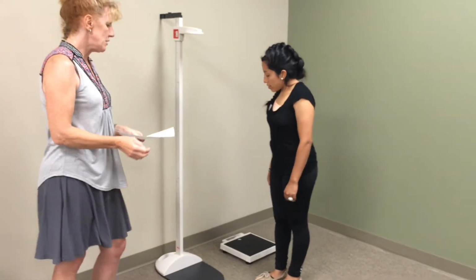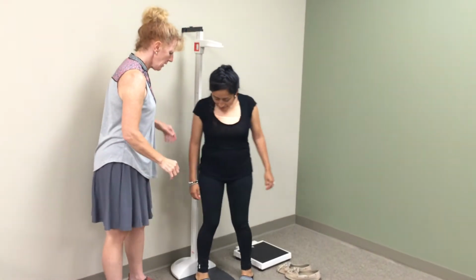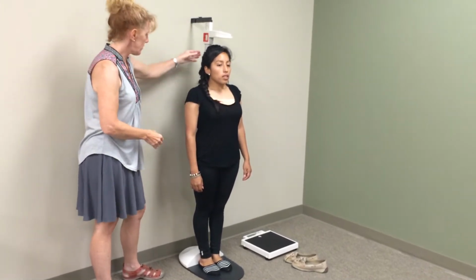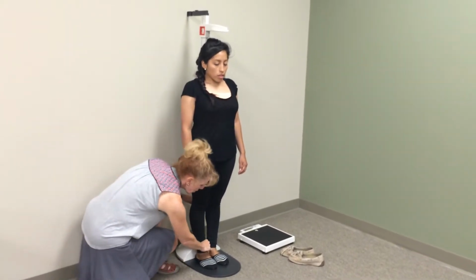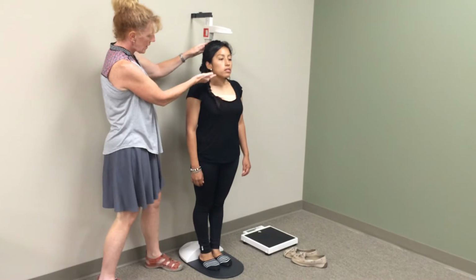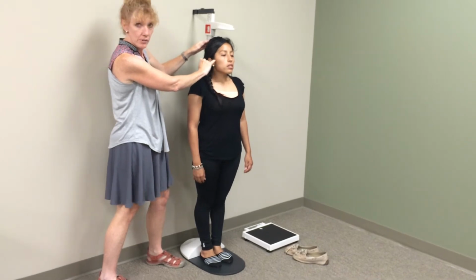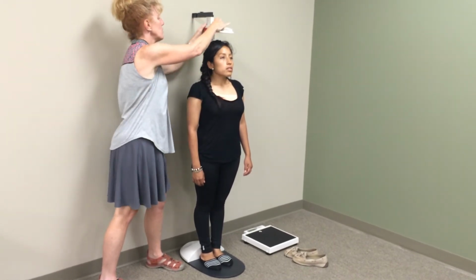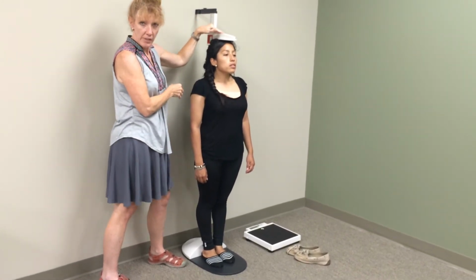The first thing that you need to do is to ask the child to take off their shoes. And you ask the child to step back into the, this is called the stadiometer, step back into the stadiometer. What I usually end up doing with kids is I end up being crouched down and I push their heels all the way back against this back part. Then the next thing you want to do is you want to make sure that the line between their ear and their chin is a straight line that is parallel to the ground, so that they're looking straight ahead. And then you say, okay, hold still, and then you slide down this device here until it's pressed firmly on their head.